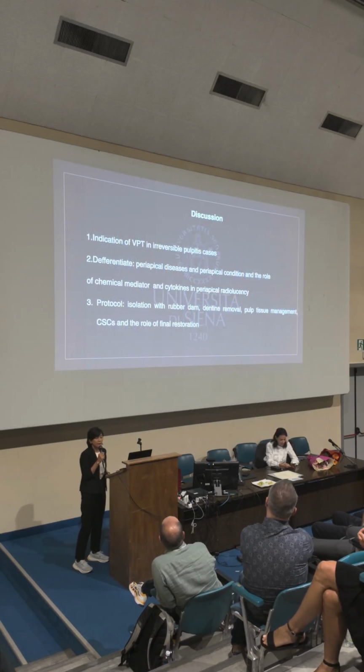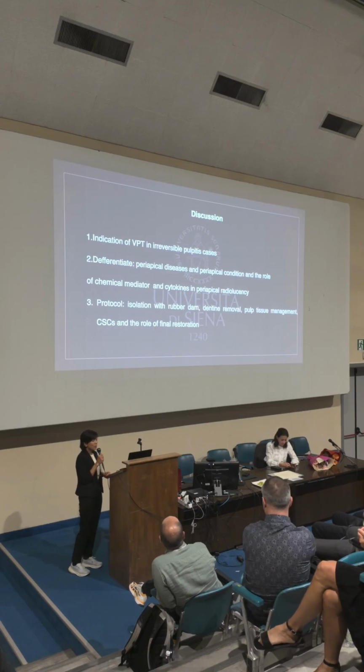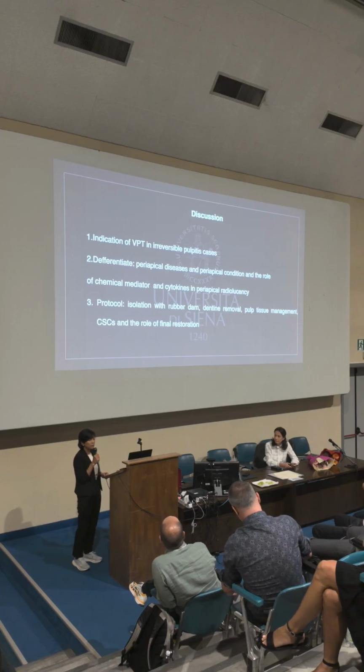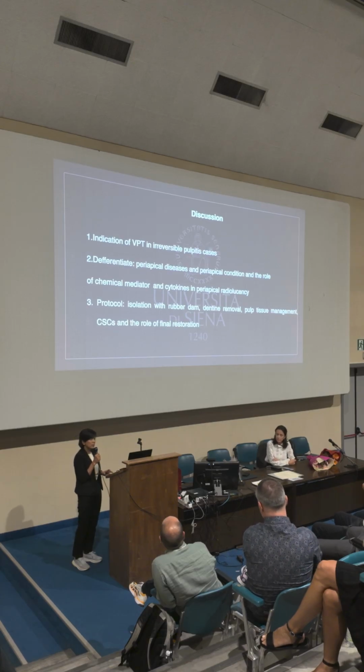And for this case, I always ask everyone and ask myself, why? So in this case, for number 4-6 and number 2-6, both teeth responded positively to the vital pulp test. So that's why, when I can save the vital pulp, I will keep it vital.